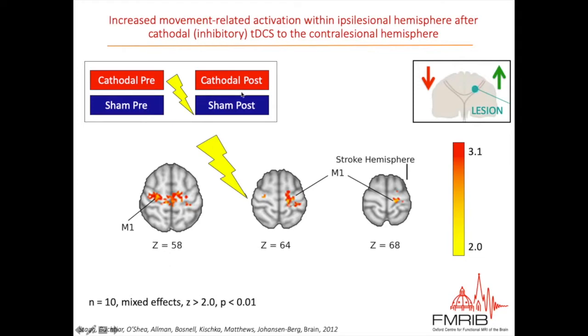So we've got these two different patterns of activity that lead to actually statistically indistinguishable maps. And that's all well and good. And you could do that with any technique, right? You could use any kind of intervention and say, okay, which areas of the brain are active when they do this task before our intervention, which areas of the brain are active afterwards, and look for changes.